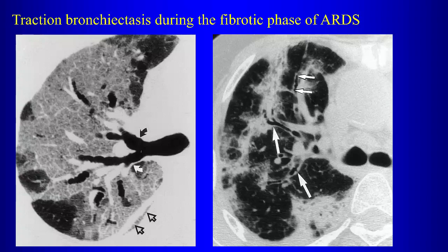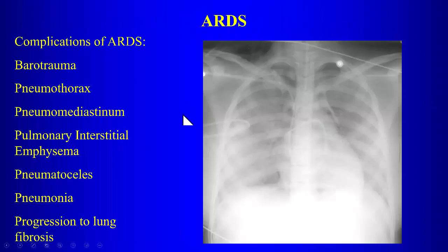Any ideas? Well, what's typical of fibrosis with UIP? We see what? Honeycombing. Honeycombing in the peripheral distribution. Do we see honeycombing with ARDS? No, we don't. Right. So fibrosis from ARDS does not give you honeycombing as opposed to the fibrosis that is typical of IPF or UIP.